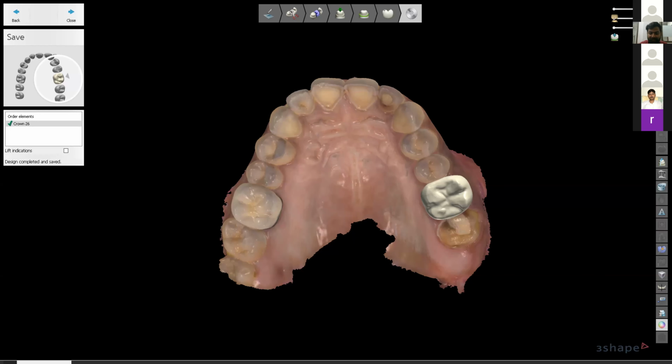So I guess, ma'am, we don't have any questions, but we would love to see if you can show us abutment designing. Ma'am, I don't have a case today for the abutment designing. Can we share a case we scanned maybe day before yesterday with scan bodies, using our intraoral camera? But ma'am, I need to check which scan body you have used. I need to have the digital libraries as well. Okay, so it's good if you just show us your file and a demo of how you are doing it.